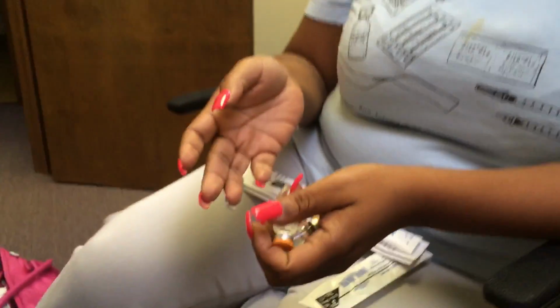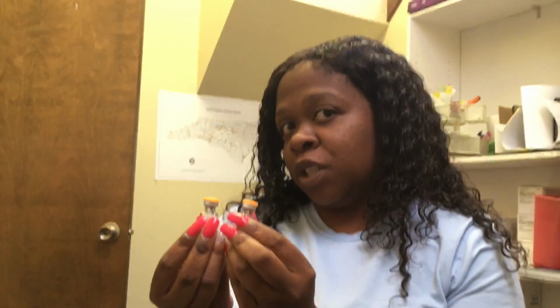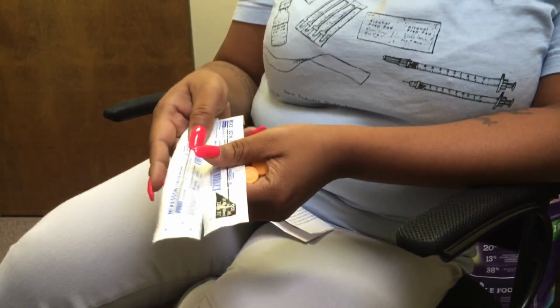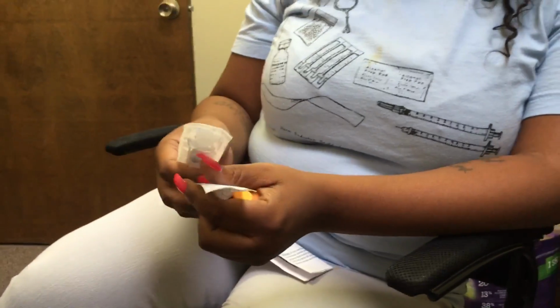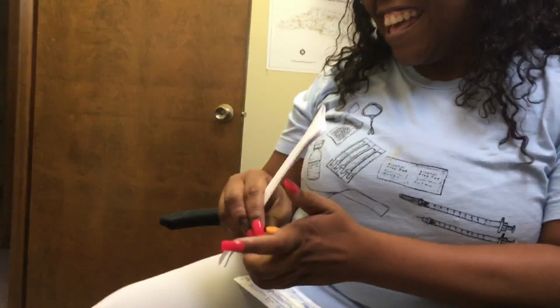These are the intramuscular kits. And in each kit, you'll find 2 doses of naloxone, 2 syringes for administration. And these are intramuscular syringes, and they're different than intravenous syringes. So it's kind of like an EpiPen. Absolutely, sort of like an EpiPen. I like that language because it's safe and everybody is okay with EpiPens. You know what I'm saying? Yeah, people know EpiPens. Yes.